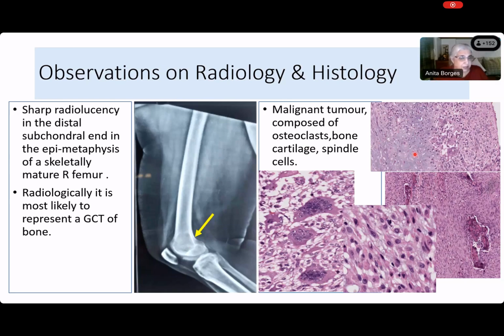So now what is this, Prayas? What do you think it is? A malignant tumor that produces bone and cartilage is what? Osteogenic sarcoma. Very good. Can you get osteogenic sarcomas that have osteoclasts in them? Yes, ma'am. Excellent. So this has to be an osteogenic sarcoma.